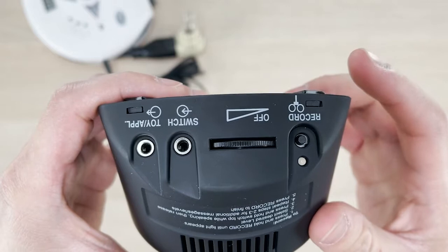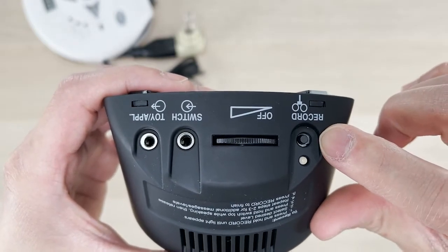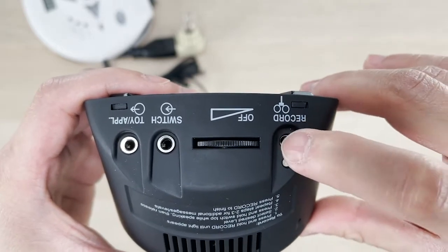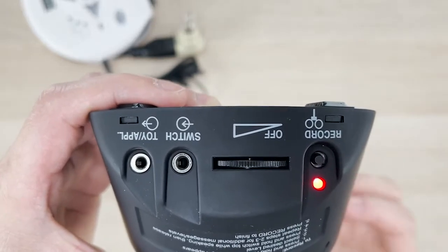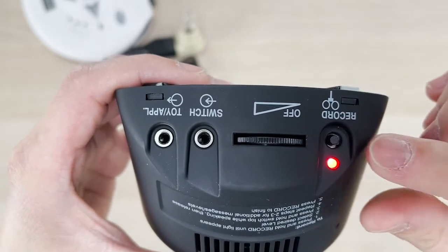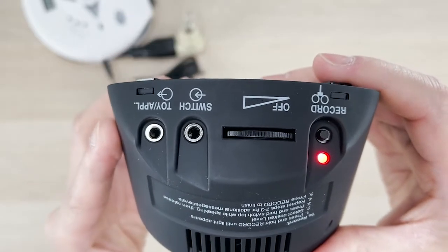To enter recording mode, press and hold the recording button for approximately 5 seconds or until the LED turns red. To record, press the switch tab and you can start recording a message. While recording the message, you want to press the recording button quickly and release it to assign the message to activate an external appliance or toy.